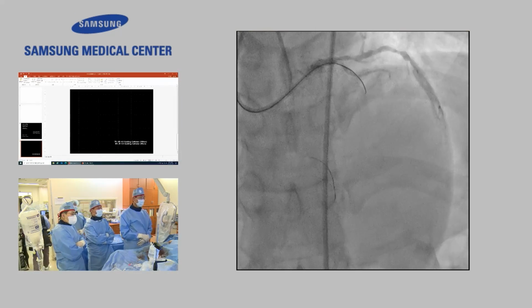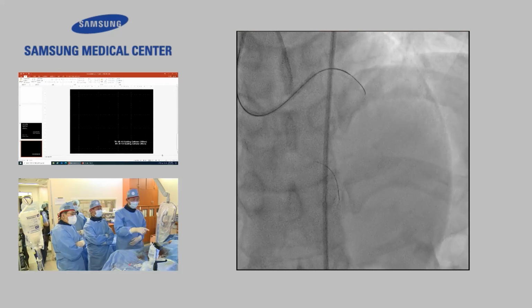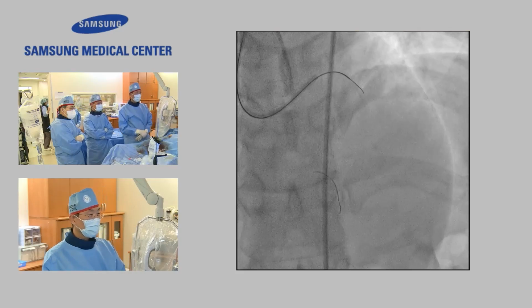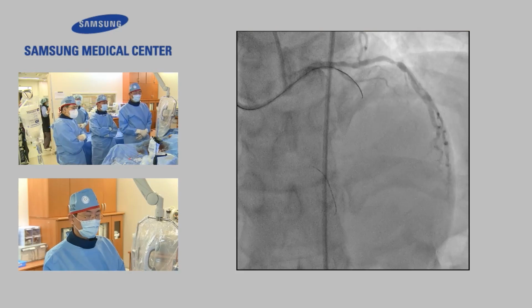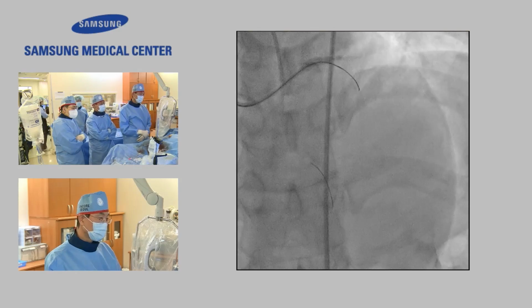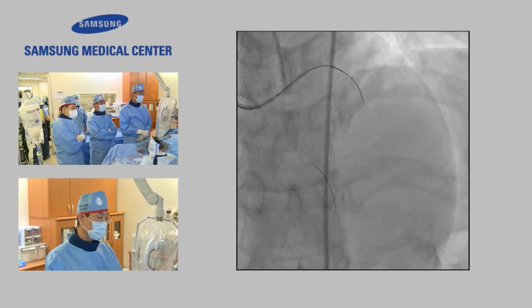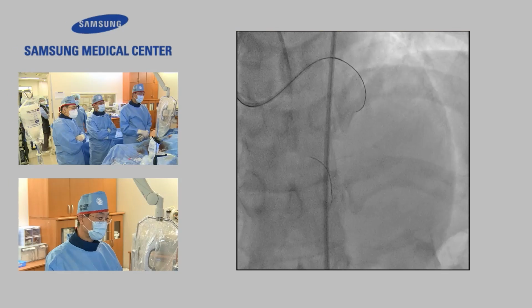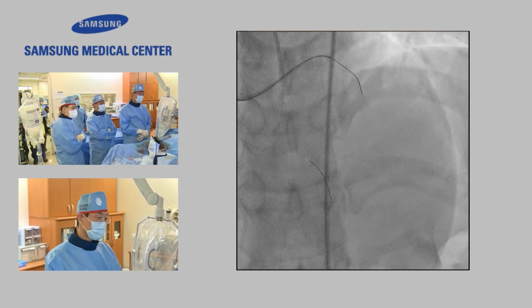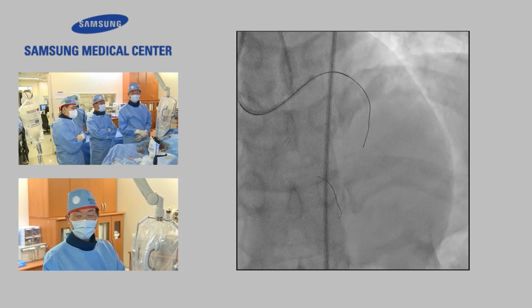So anyway, I'll show the circumflex collateral afterwards. I tried the SUOH3 wire supported by the Corsair extra small. Next. It was very, very quick. This is live, almost live. And this is septal. This is LAD. Okay, just 10 seconds.